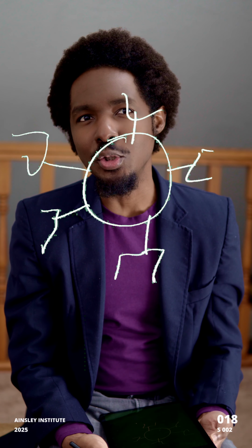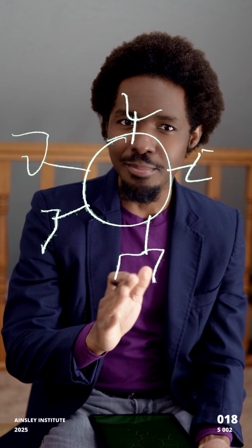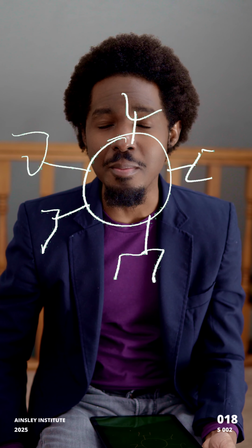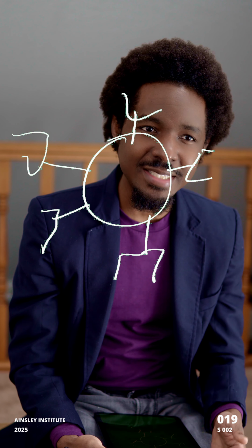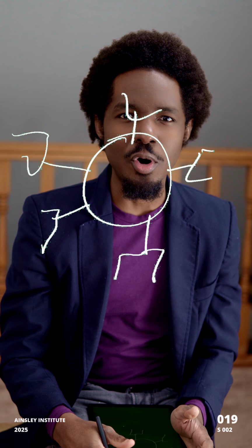So ABO blood group is the most frequently performed testing in the blood bank. Both the ABO forward and reverse grouping testing must be performed on all donors and patients. So the donor has to be tested, the patient has to be tested, because this is the simplest form of compatibility.